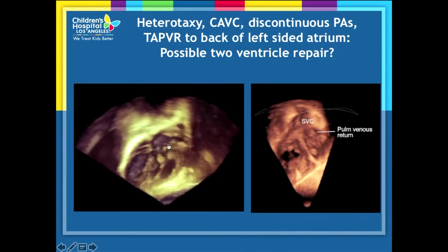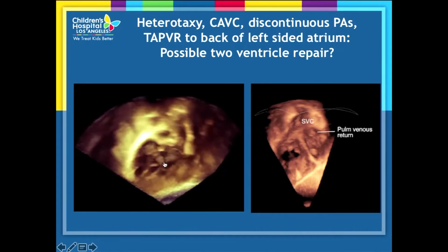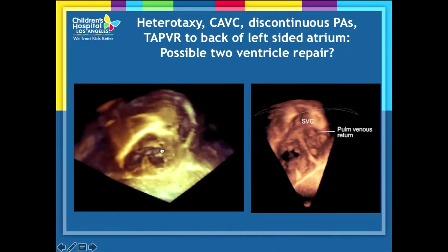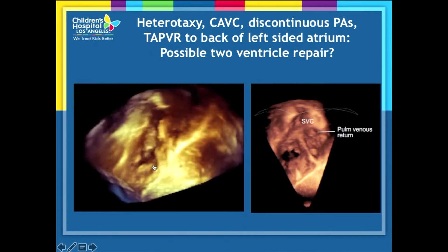There's a VSD component. There's the ASD primum component, the aortic valve coming off of here. And I think what was very useful here is really to see the attachments of the AV valve leaflets and how they would appear to interfere with a baffling of the left ventricle to the aorta. And not only that, how unbalanced this AV canal was. It's not just that the ventricles are different in size, but actually the AV valve itself is unbalanced and significantly favors the right ventricle right over here.